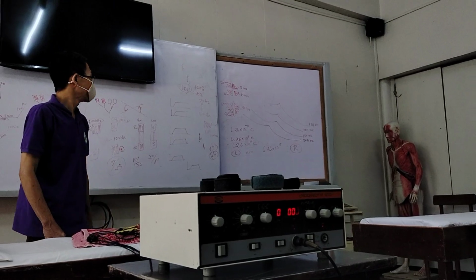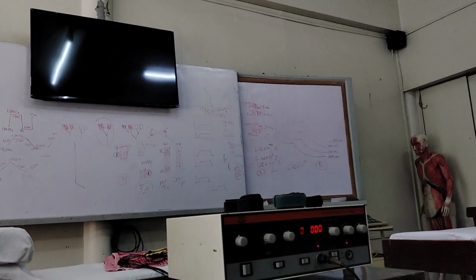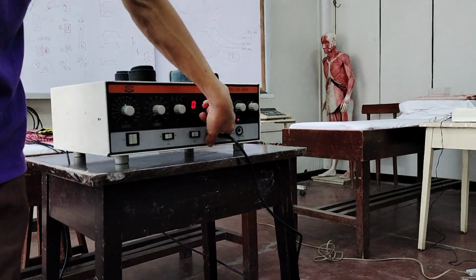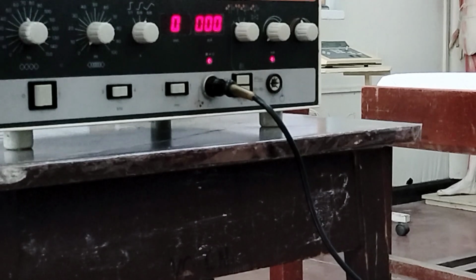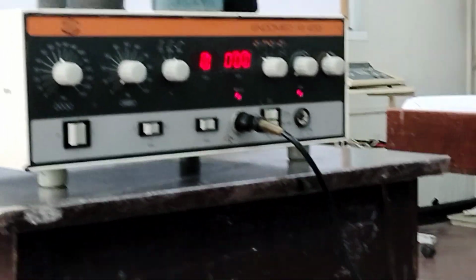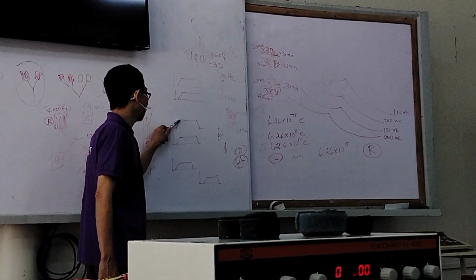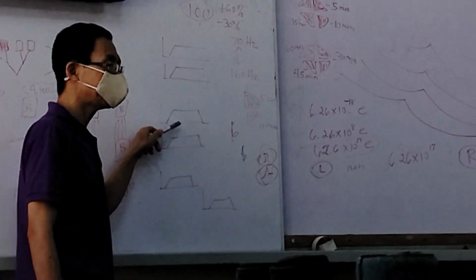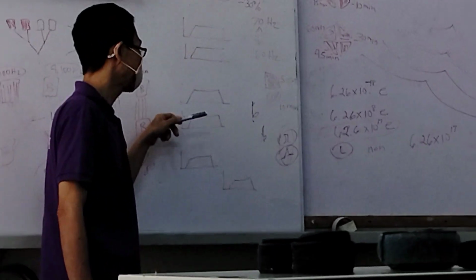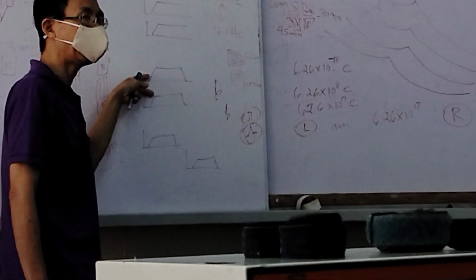Okay. Next, going towards the left side. You can now see that it goes up, stays straight, and then goes down. So that is the rest. And here your illustration is at the same level.